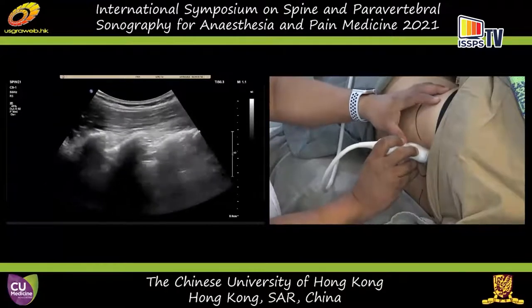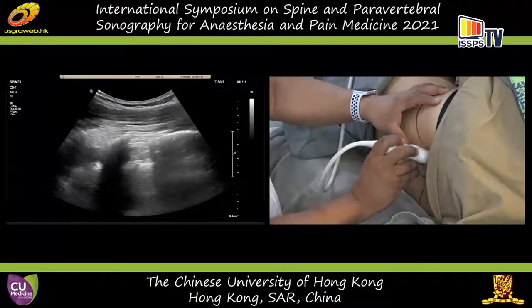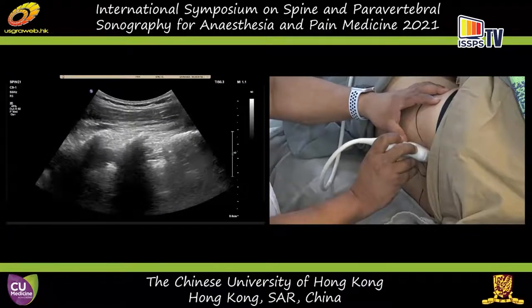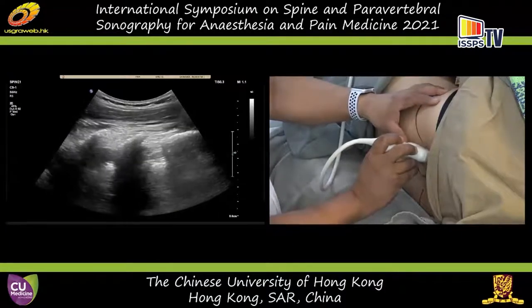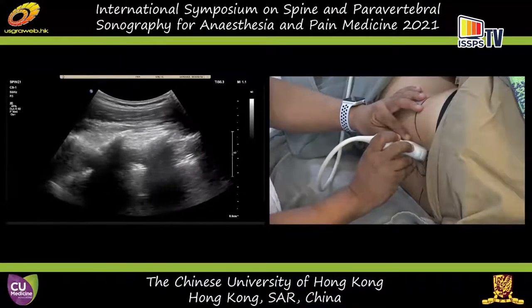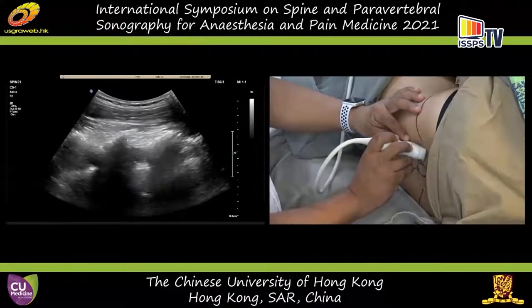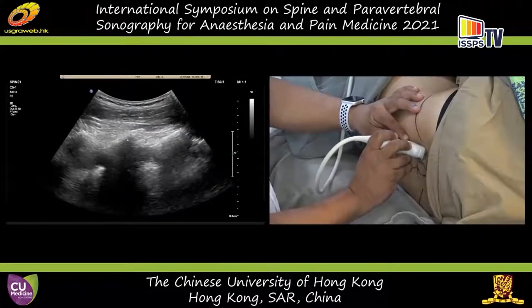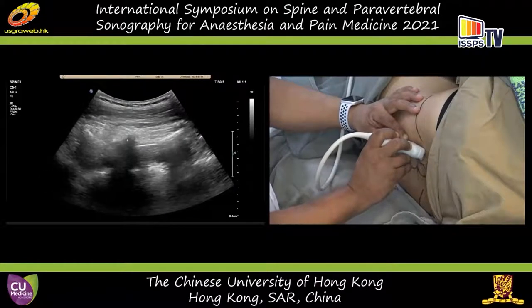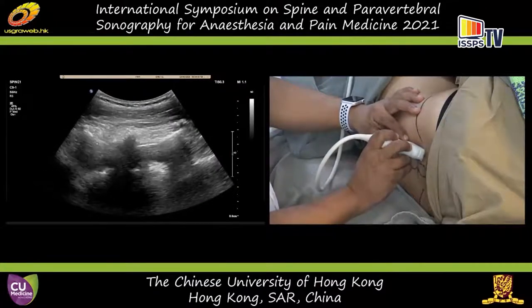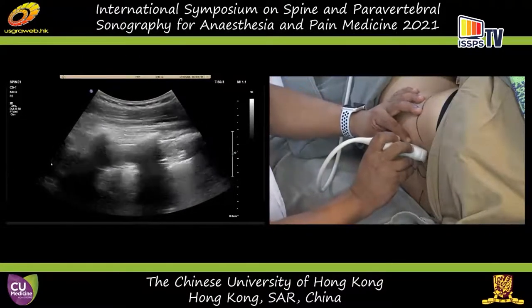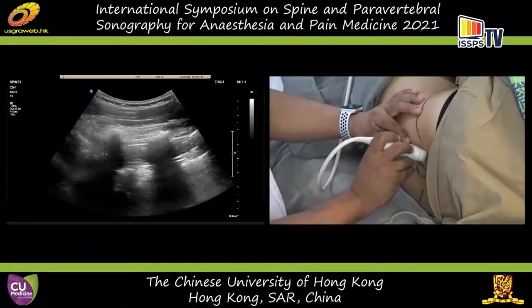Here's your sacrum and the lumbosacral gap, which is L5-S1. You see the lamina of L5 and the lamina of L4. So you can come cranially and see that this is L3, L4, and L5. Given this anatomy, I think L4-L5 is the interspace I can see best here.